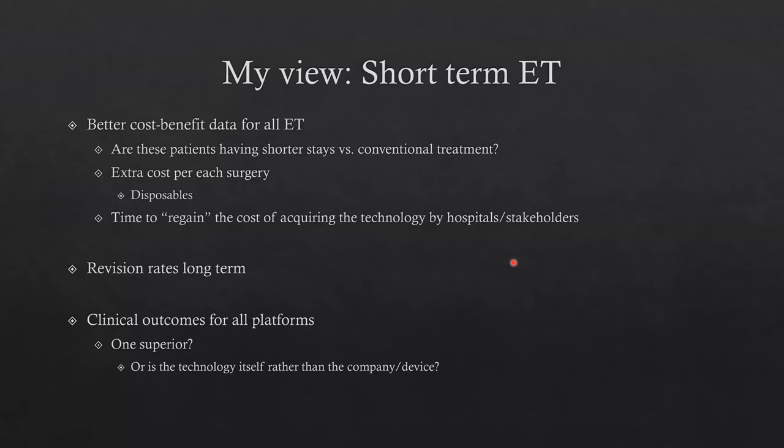Yes, there are, and they're all the same hospital comparing before they acquired the technology and after they acquired the technology. Off the top of my head, I think it was around 30 cases when the teams know how to set up everything and it becomes almost the same time as your regular TLIF. Because as you bring the robotic arm, you have to attach it to the bed, and at the beginning you may not have it draped all the way and people don't know how it works. So at the beginning, your procedure is going to be longer, usually between 30 and 40 minutes from the paper that I know that compared that. But then around 30 cases, it becomes almost the same time as the regular TLIF time.